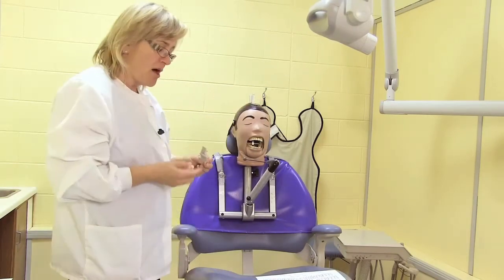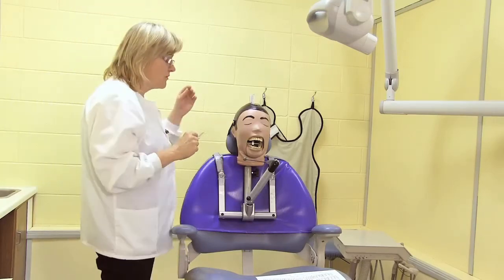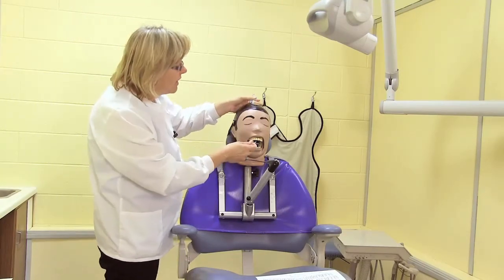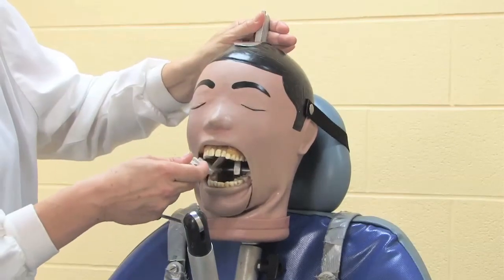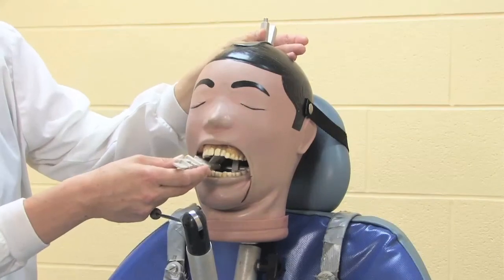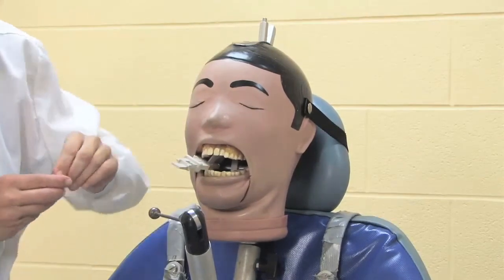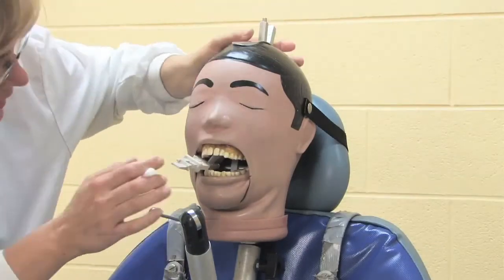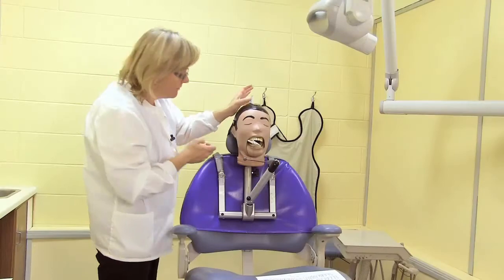In our molar shot, I won't change the film. I'll use the same film. We haven't exposed it, but just for demonstration purposes. And I'll go back slightly, use my landmark, which is the distal of the second premolar. In this case, our second premolar would be the 1-5. I place my film. Again, I'm cognizant of the fact that I want the film as close to the teeth on the lingual as possible.